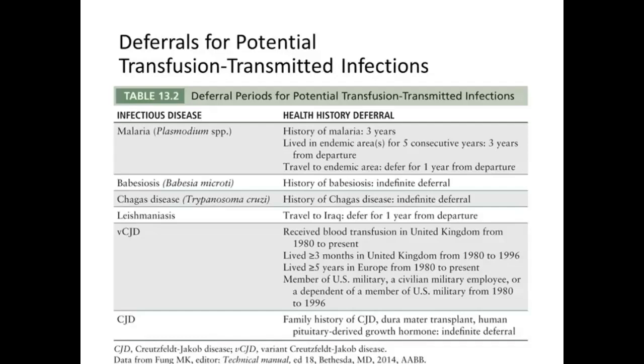This is a test that's not often done, but normally units for babies are collected in what we call the large donor bag, and then they may have 4 little bags attached to it called satellite bags. They'll save some units off of the sides for infants.